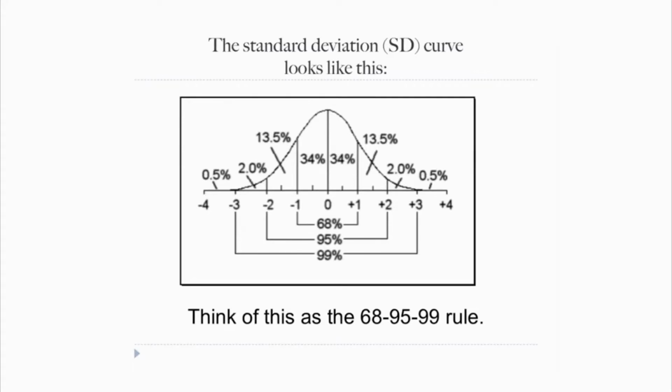That means that they will fall within that category of being more than 1 standard deviation away from the mean. So it's kind of artificial in the sense that even healthy young women, 16% of them are going to be called to have osteopenia, and even 1% will be told they have osteoporosis, simply because this is a statistical calculation of standard deviation.